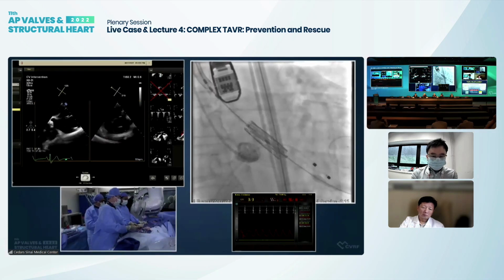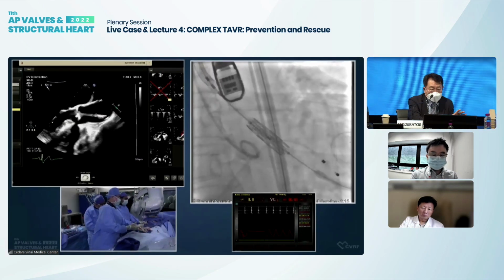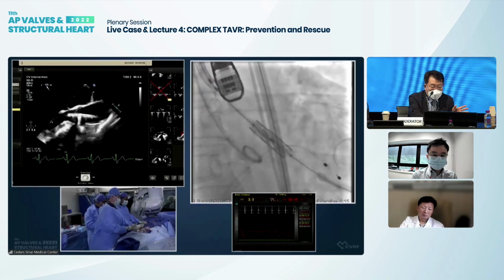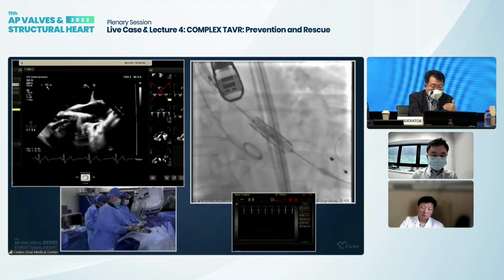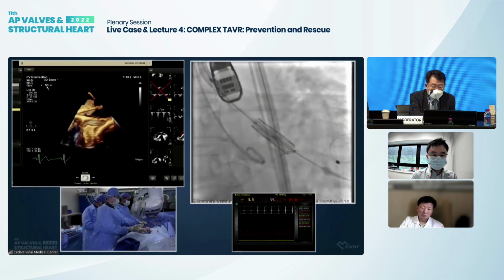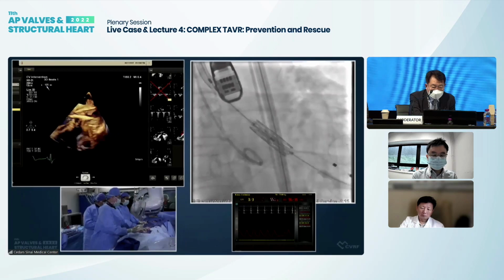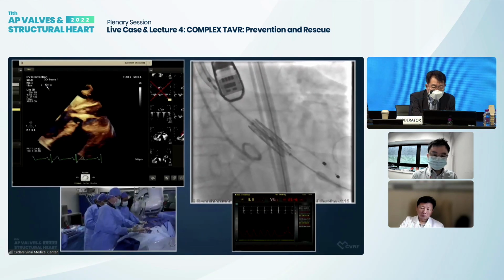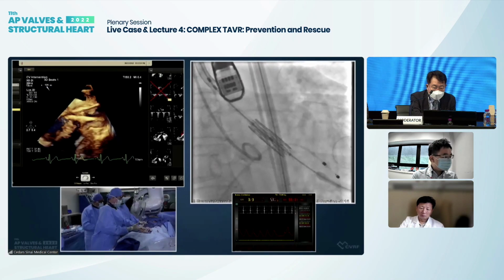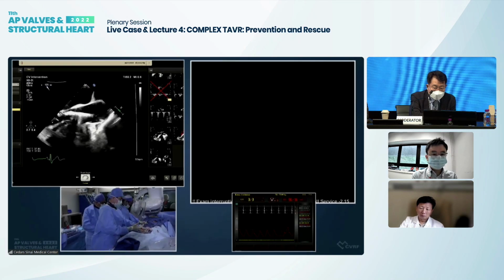Right. I personally think a little bit higher position. However, it's okay in case of a bicuspid aortic stenosis. All right, but I agree with you. We'll try to keep it there and not let it move up. Okay. Sid, are you happy? Yes. All right, okay, everyone.